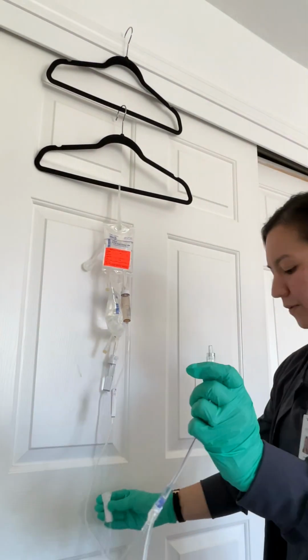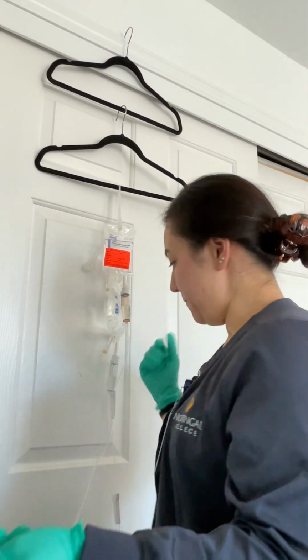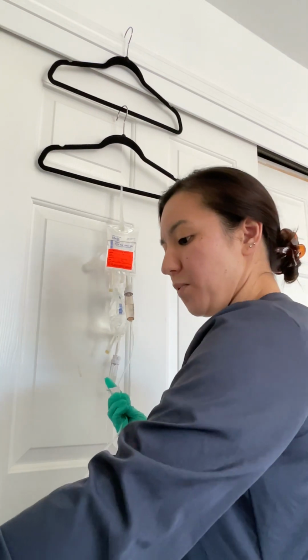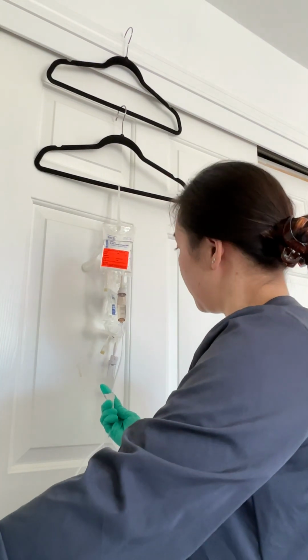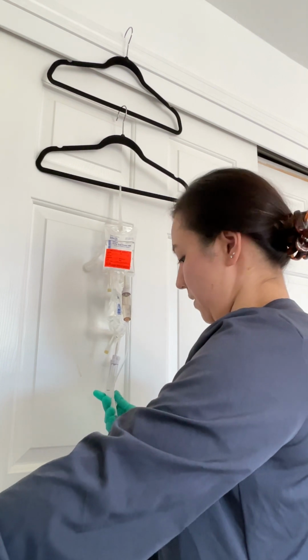All right, so now that this one's attached, we're going to prime this tube. Because this other line is clamped, we don't need to worry about anything coming out yet. So we're going to prime this tube, making sure that we get out all of the air bubbles.